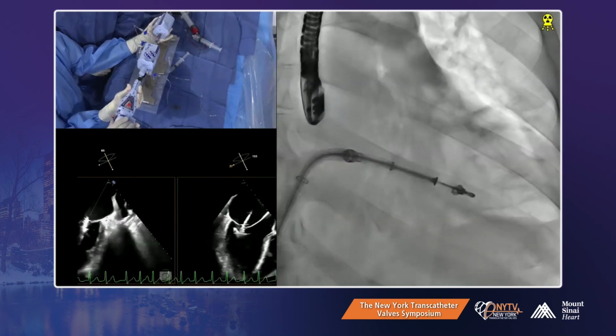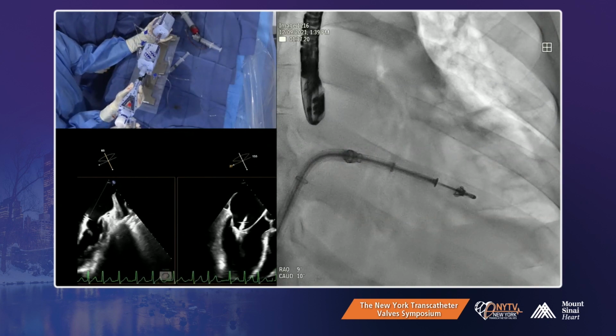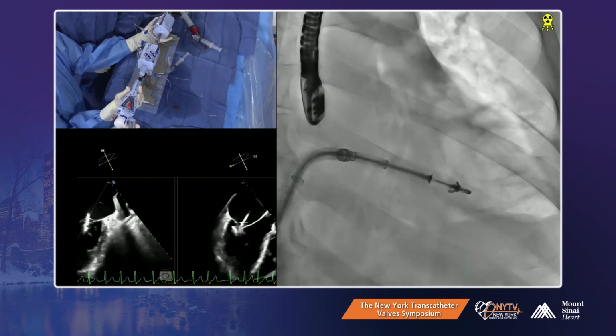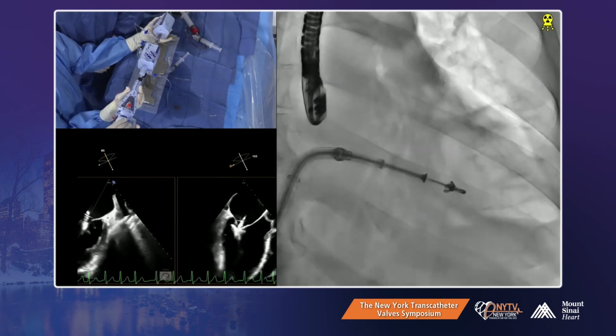Yeah, exactly. Opening the clip arm. That's looking a little better. And now we are going to go. You're gonna scoop posterior. Come posterior. Yeah, pull up a little. Problem is the heart rate. If the heart rate is slower, this would be less challenging.